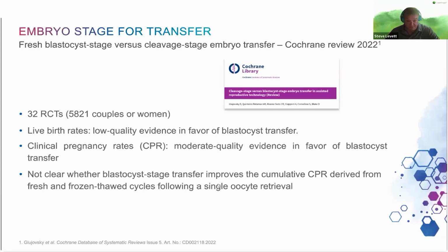If we're going to do blastocyst transfer, one of the key factors is that we have our culture system optimized. The longer the embryos remain in our lab under our control, the more critical that the conditions remain optimal over that extended period of time.